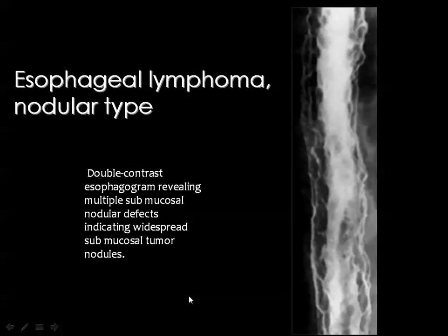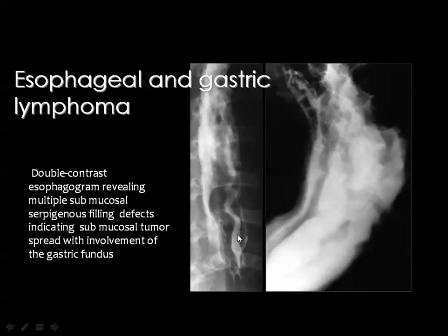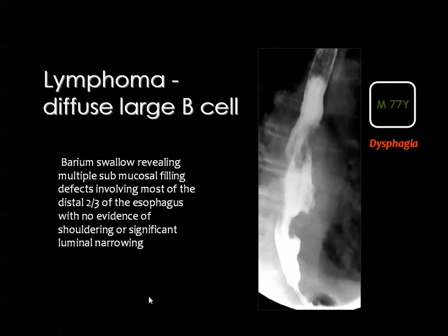Then esophageal lymphoma. One of the patterns of lymphoma in the whole gastrointestinal tract is diffuse mucosal thickening to a significant degree like this. And this is the esophagus, and you see that the mucosa is markedly thickened, and it does not usually produce obstructive changes, especially in the esophagus, but you may predict the lesion by this. You can see huge thickening of the mucosa, and this may also extend into the stomach in a combined lesion affecting the esophagus and the stomach as well.